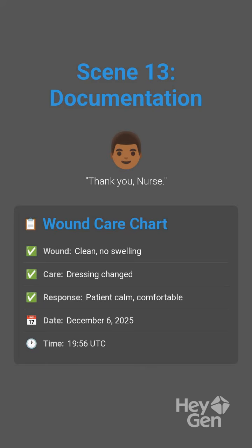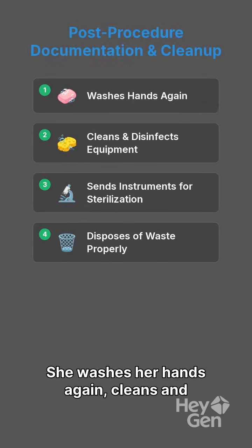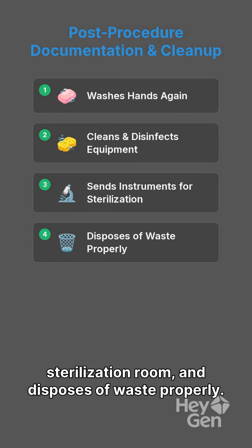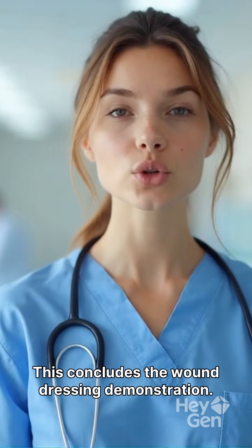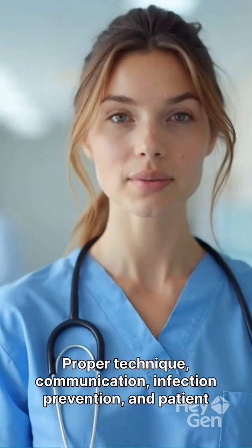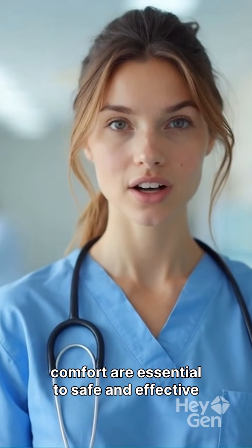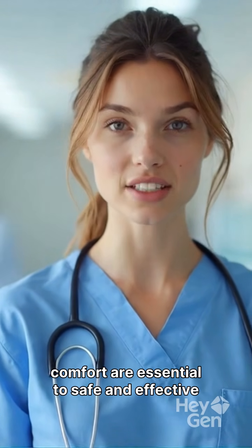She washes her hands again, cleans and disinfects all equipment, sends instruments to the sterilization room, and disposes of waste properly. This concludes the wound dressing demonstration. Proper technique, communication, infection prevention, and patient comfort are essential to safe and effective wound care.